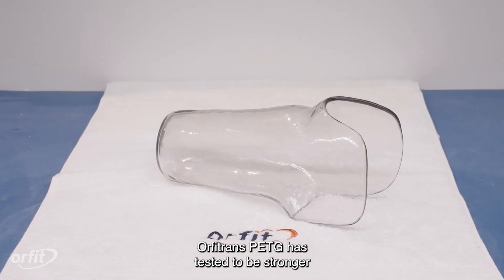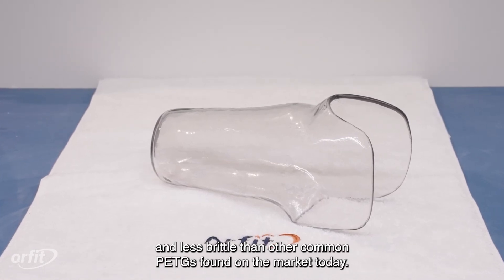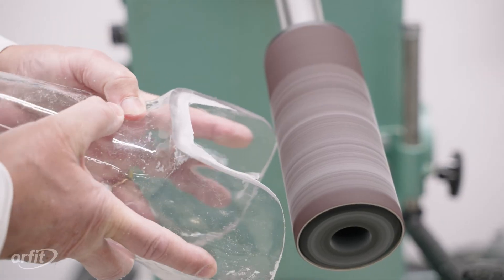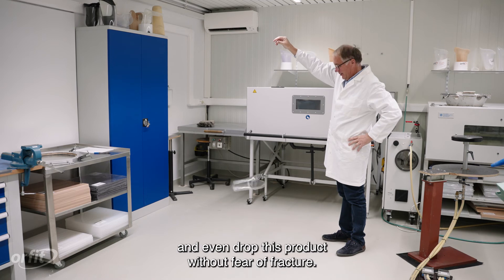Orfitrans PETG has tested to be stronger and less brittle than other common PETGs found on the market today. You can drill, grind, scour, cut, and even drop this product without fear of fracture.